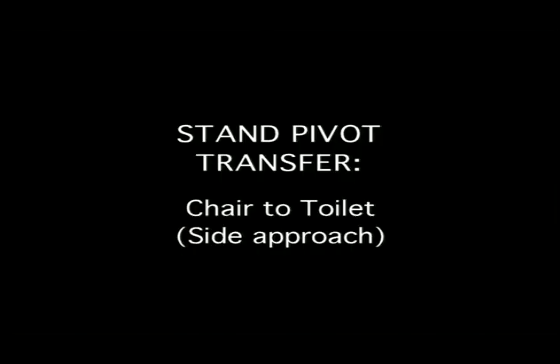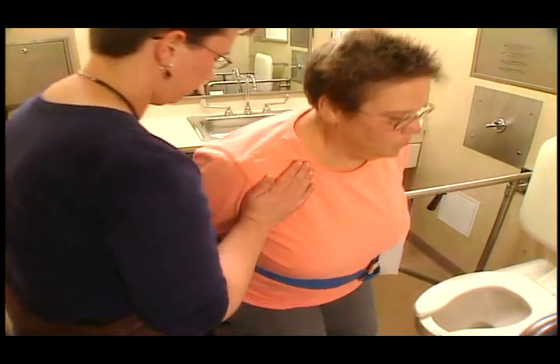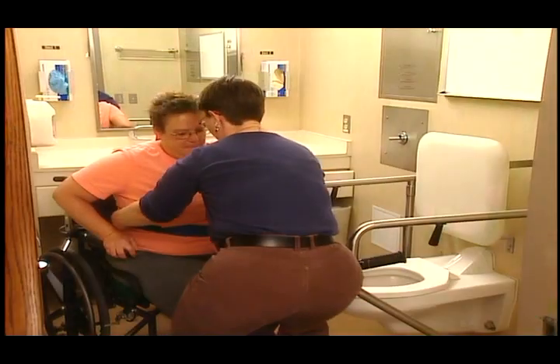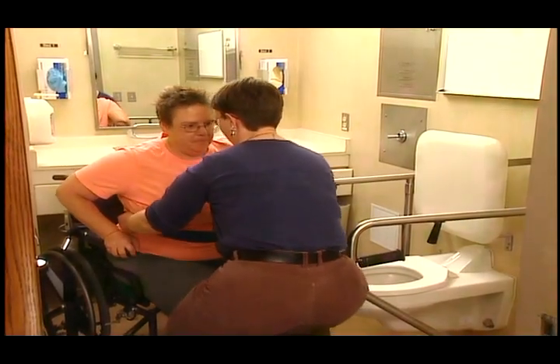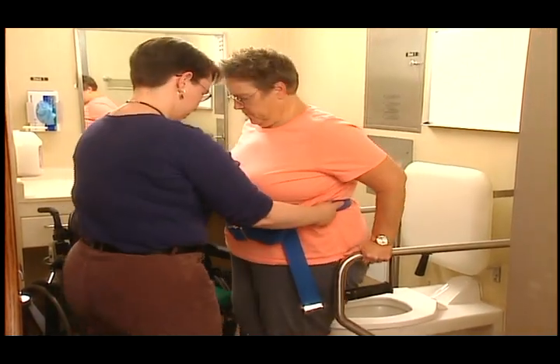Here the therapist is demonstrating a stand pivot transfer in which she positions herself alongside the patient. Again, the patient is able to push off from the armrests into a standing position. When performing any transfer, the therapist must be sure to position herself correctly, or the transfer will not go smoothly.